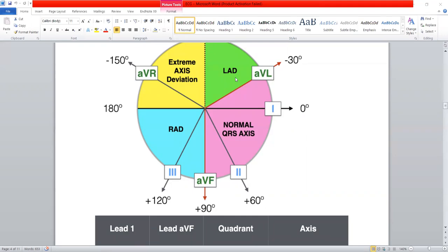And if the direction is more towards the right side, then we will call it as right axis deviation.